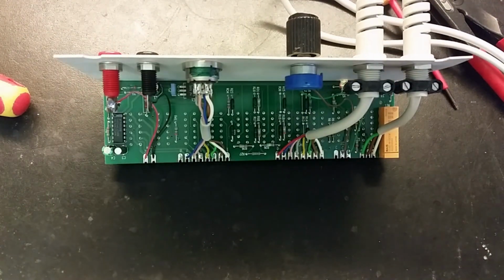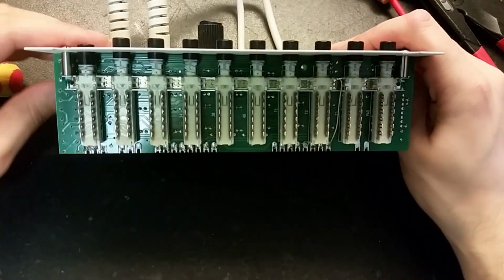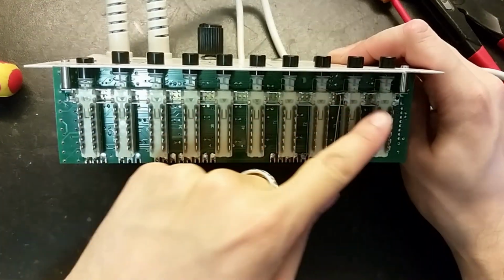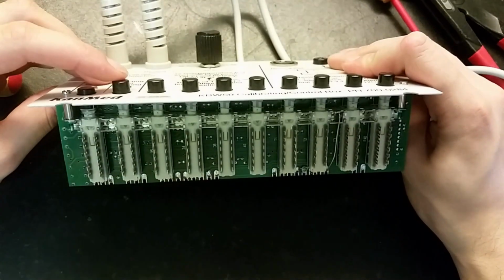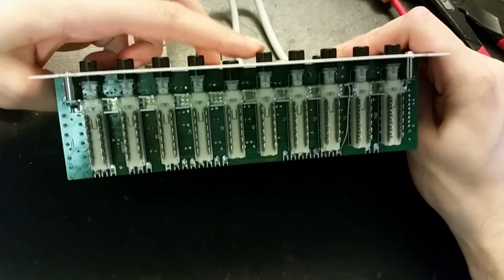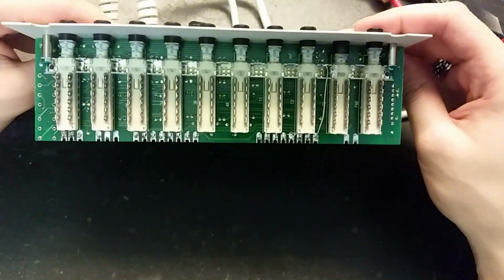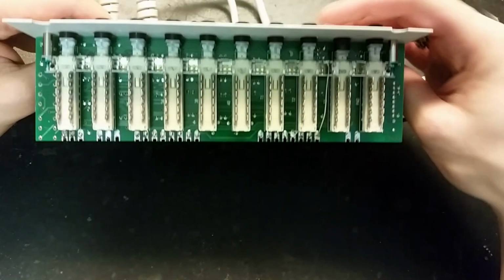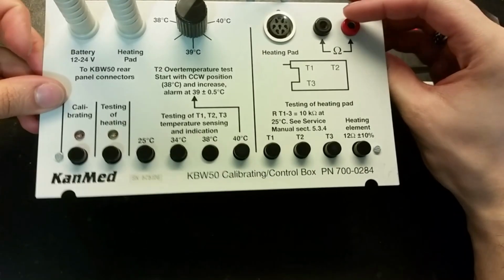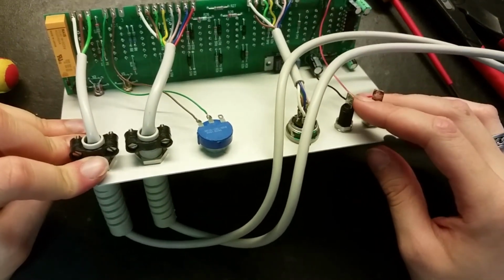Let's have a look at the tester. First of all, the tester has this long array of push buttons, and they're all mechanically connected together. So if I push in one button here, it disconnects the first one. It goes like that. I think that's the largest switch that I've seen that are connected together like this. There are many switches. And I've got a pretty high quality Cermet potentiometer.